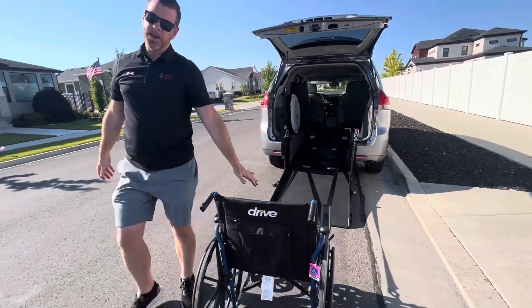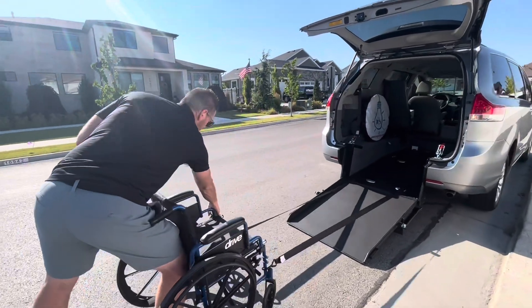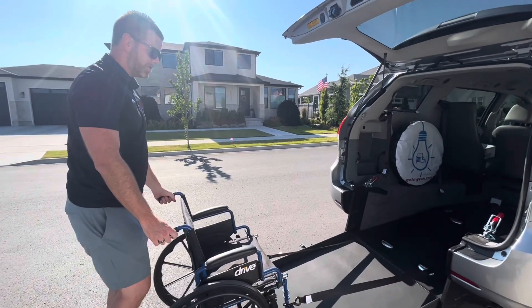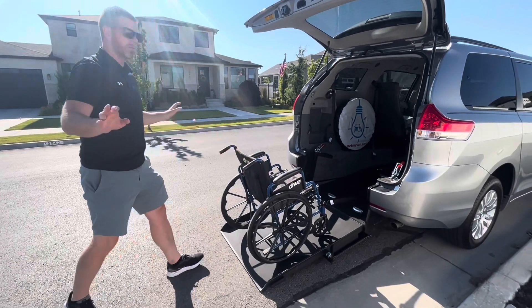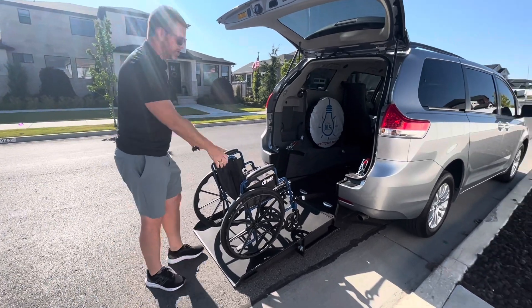So your patient is loaded and your Q-Straints are attached to the frame. Now I'm going to start pushing this wheelchair into the van. Let's say I get distracted or have to do something — I can back off the wheelchair and those Q-Straints will maintain the wheelchair where it's at.